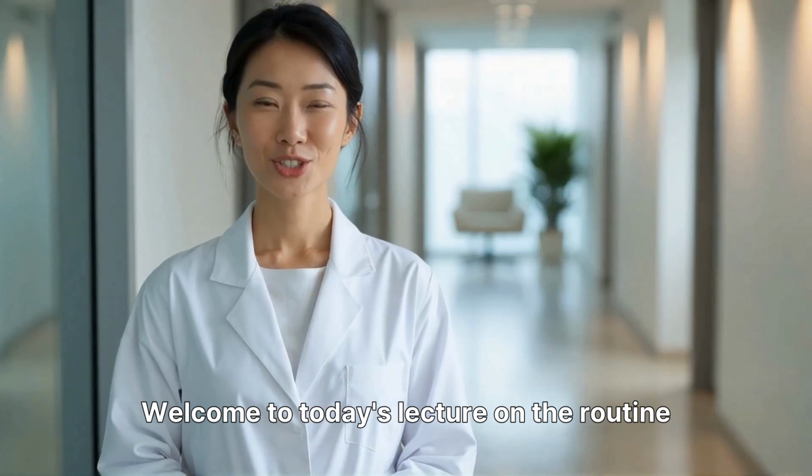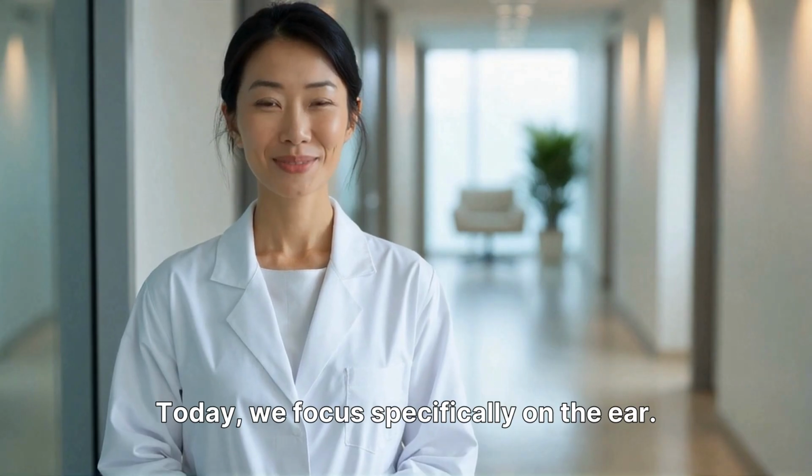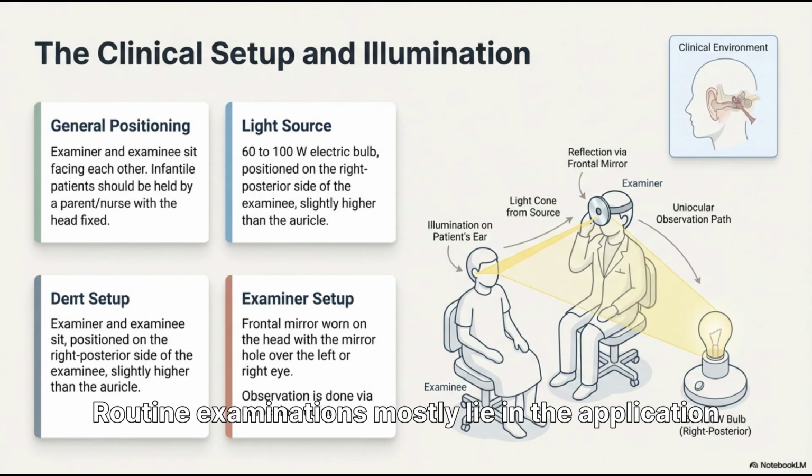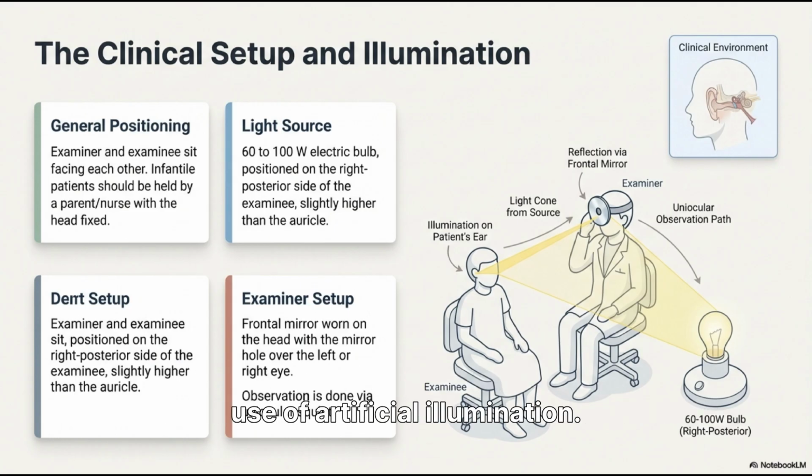Welcome to today's lecture on the routine examinations of the ear, nose, and throat. Today, we focus specifically on the ear. Routine examinations mostly lie in the application of special instruments, together with the simultaneous use of artificial illumination.